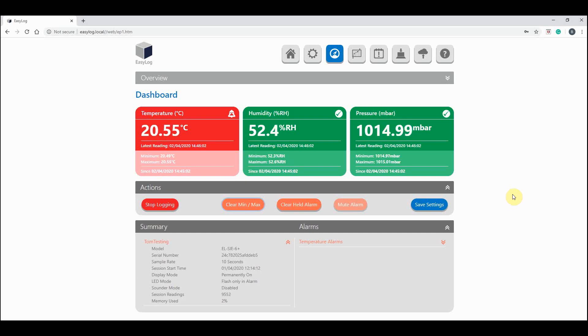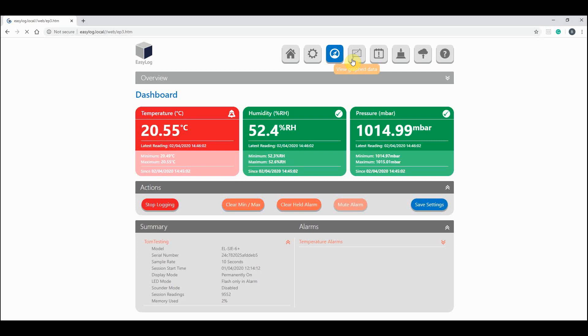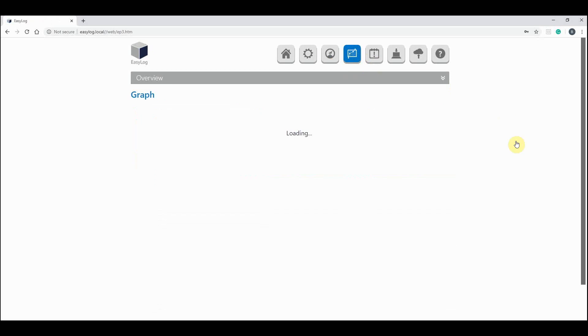The EasyLog software will also graph all your collected data for you. To view this, click view graph data at the top of your screen. And here will be all your recorded data. The data in this graph is from when I started this current login session.